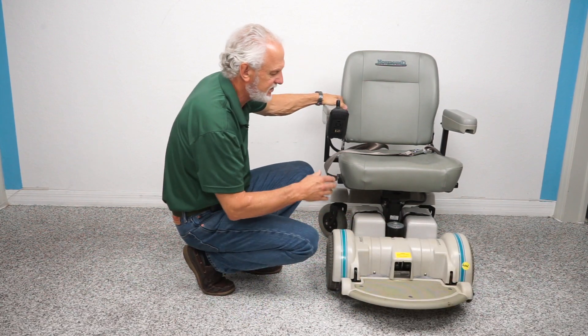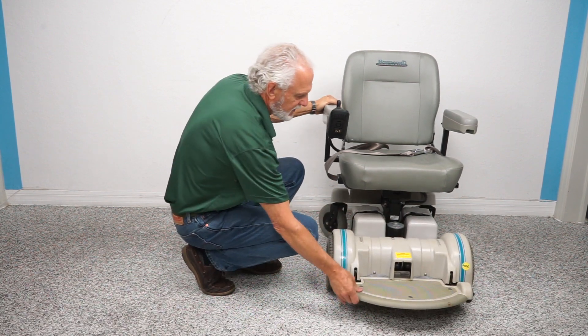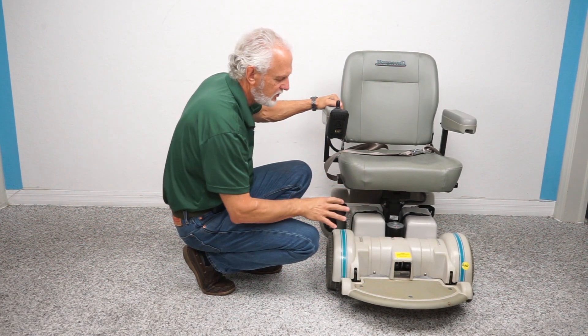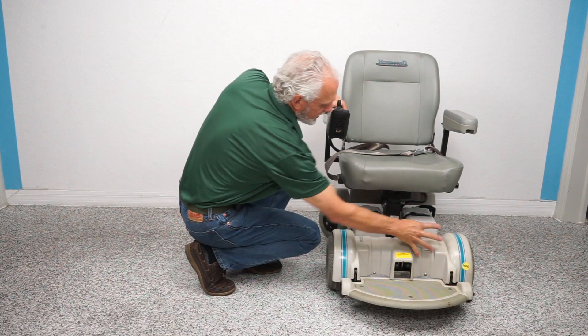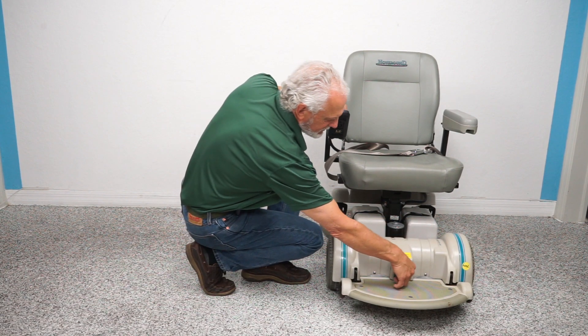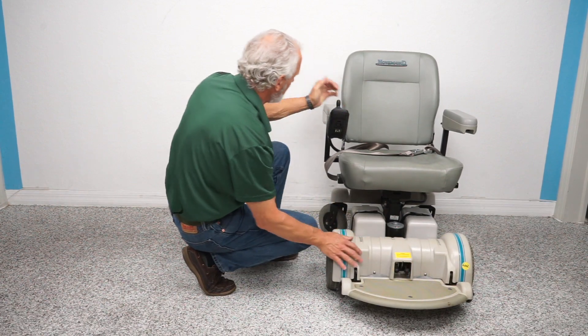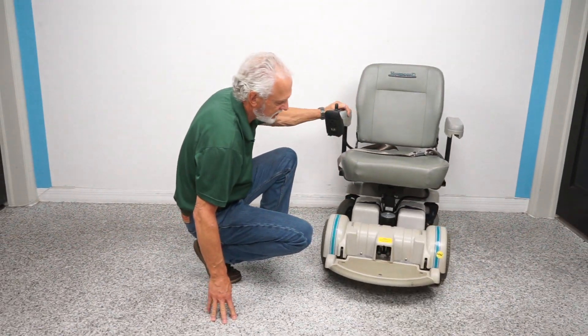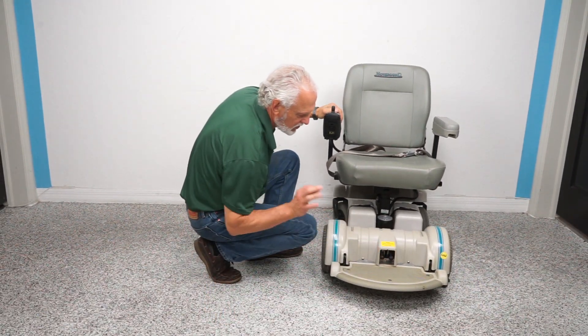If you ever want to put this chair in neutral to roll it, turn the power off first because these are electric motors. Go to the handle area and you'll see little black knobs — push them down, one and two, and now you're in neutral. Nothing is holding the chair from rolling forward.